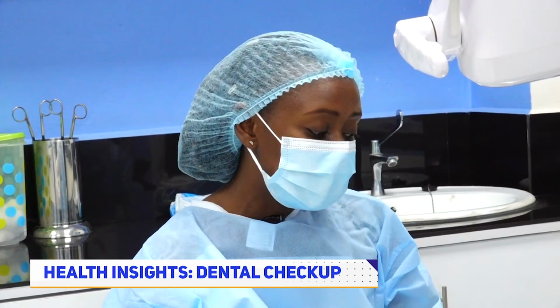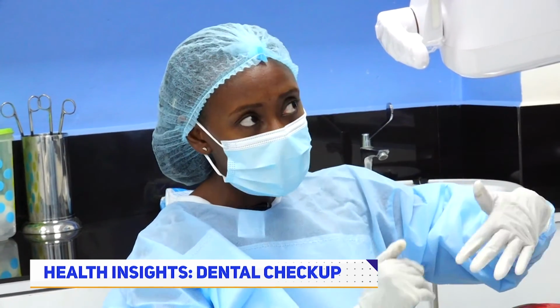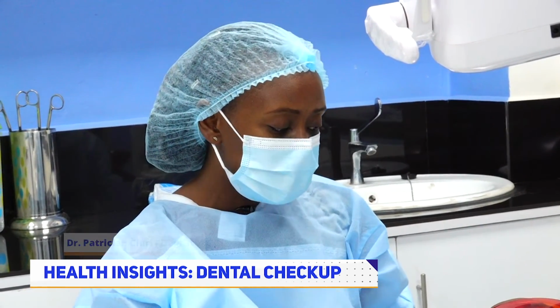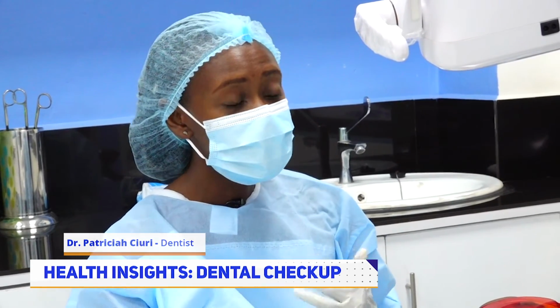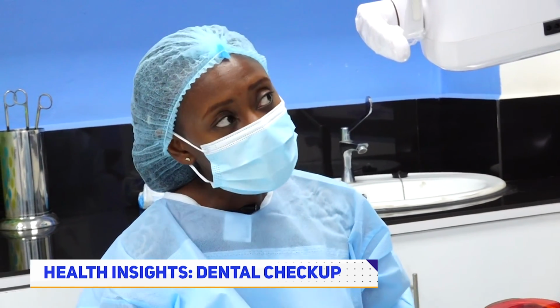If it's a first-time visit, sometimes you might ask for x-rays of the whole mouth, of all the teeth, so that we're able to see the general state of the teeth at that particular time. If it's a continuing patient and we have their old x-rays and we have already done treatment, we just confirm that the fillings are fine, that the patient is not in any pain, and that there is no infection. We don't have to keep doing the radiographs.